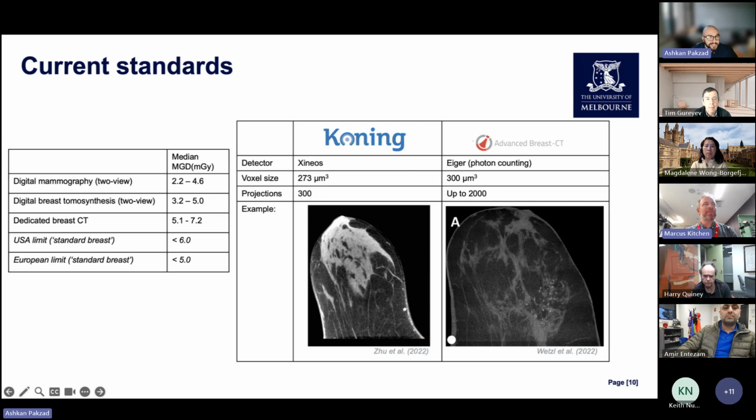Like if you had the same dose, but more dose in fewer projections, or less dose per frame but more projections, would it handle it better? I guess because with fewer projections you probably get more streak artifacts, which is a different kind of noise. So would it handle the random noise better or structural noise?